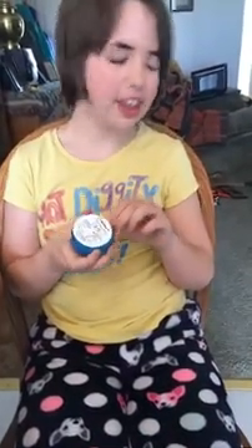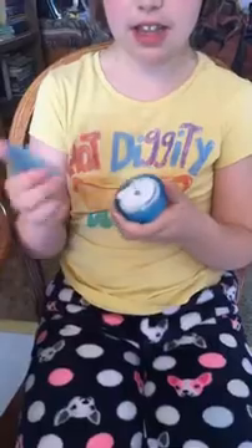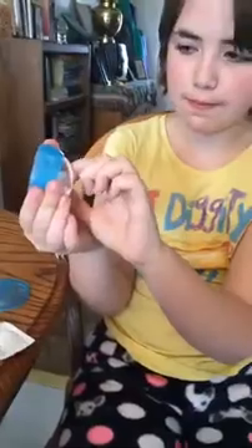Get your iPort. We need to clean the site for that one too. Reusing an alcohol wipe is just ridiculous. First, take off the plastic, then pull up this tab — there we go, pull that off, take this lid off. There's the needle guard — this is my favorite part. There's the needle part. Twist and pull — there's the needle that will insert the cannula. Then you pull it back until it clicks. Clean your site. She's a pro at this now.